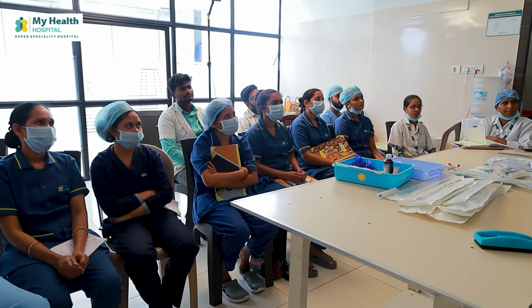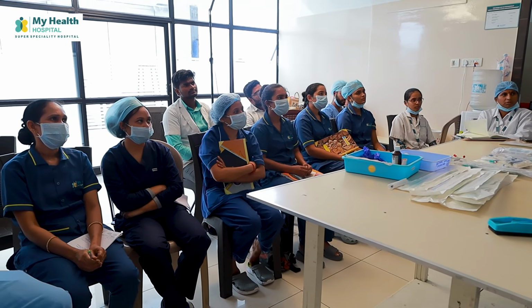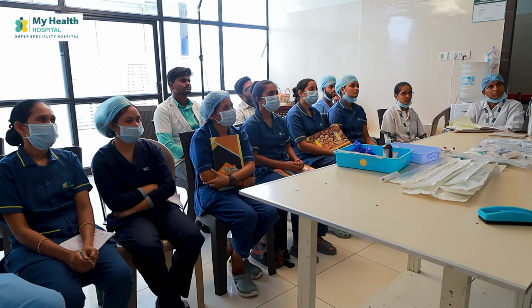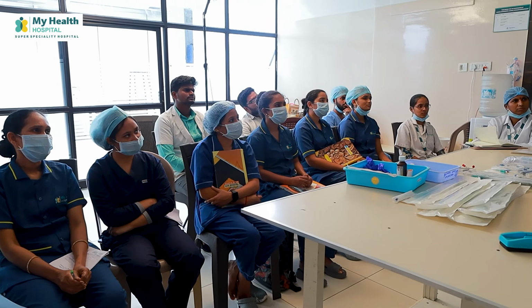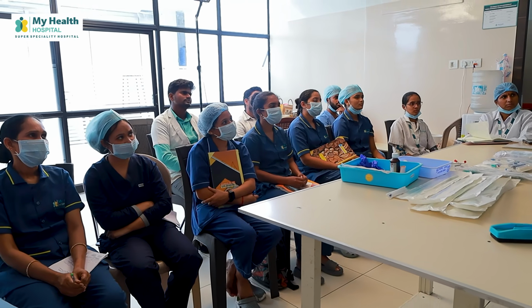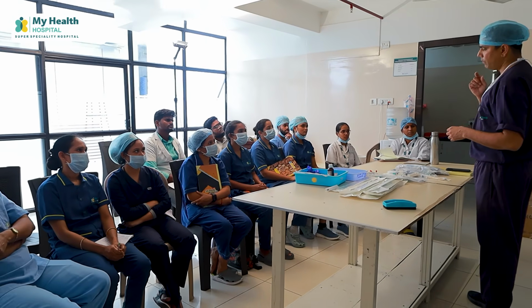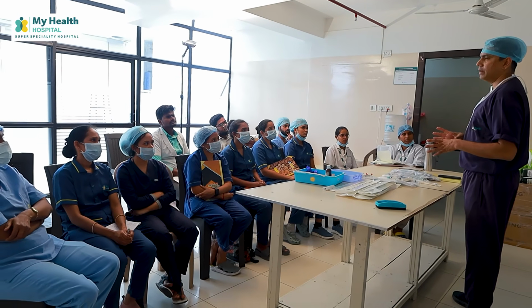So on the first day when you do trial feeds, you will get to know if the patient is tolerating or not. If the patient is tolerating well, you will calculate for the entire day how much he is tolerating. You will make a quantity of the feed that you are going to give and divide it into proportions, second hourly, third hourly or fourth hourly, and feed the patient. Got it? And every feed should be preceded by aspiration, mandatorily.